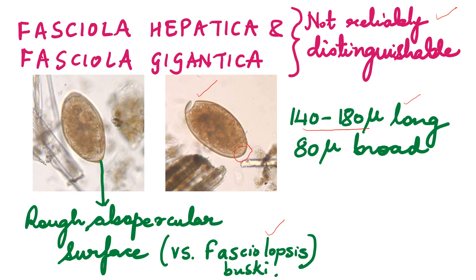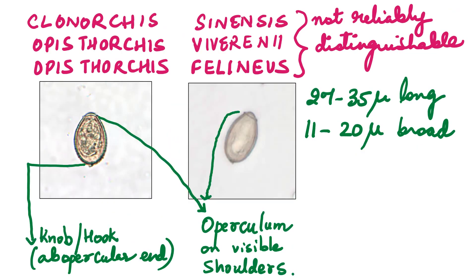The other three liver flukes — Clonorchis sinensis, Opisthorchis viverreni, Opisthorchis felineus — their eggs are relatively very small, almost one-fifth the size of Fasciola eggs. It is very easy to tell this is Fasciola or either Clonorchis or Opisthorchis. Amongst Clonorchis and Opisthorchis, it is very, very difficult to differentiate. They almost look the same.